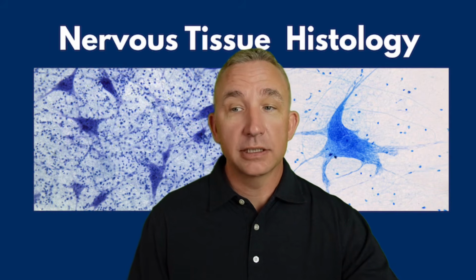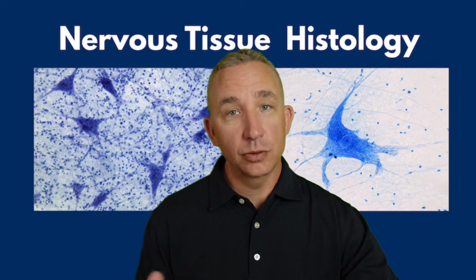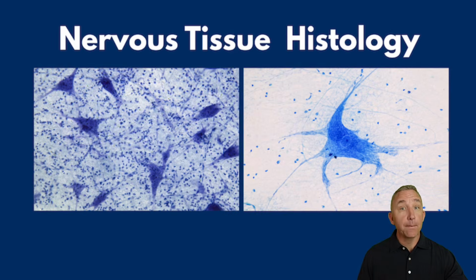Remember when we looked at our different types of neurons, we said there's anaxonal, pseudo-unipolar or unipolar, bipolar, and then multipolar. Our focus here is looking at multipolar neurons that have that motor function. On the left side here, this is an expanded view. If I go into higher magnification, we're looking at just one multipolar neuron here.